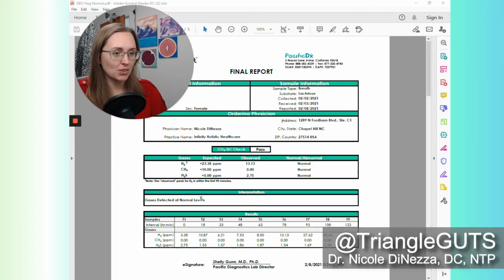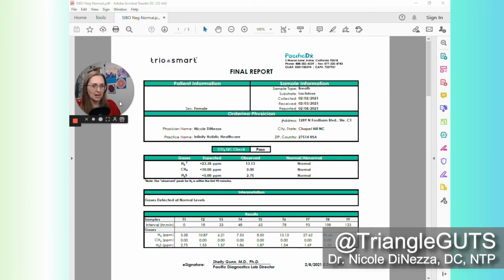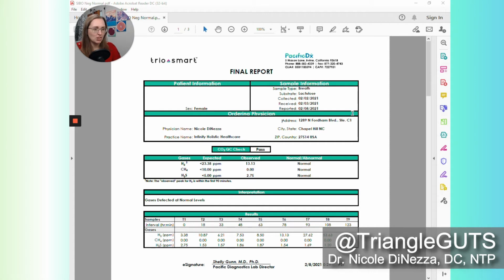So you can see on my screen that I pulled up one of the SIBO tests and I've whited out all of my patient information. So this is totally HIPAA kosher. But the first thing you want to do when you're looking at interpreting a SIBO test is there's two initial steps. First, you want to look at what the substrate was, or what the sugar was, in order to test for SIBO. So you can see in this case, this was a lactulose breath test.